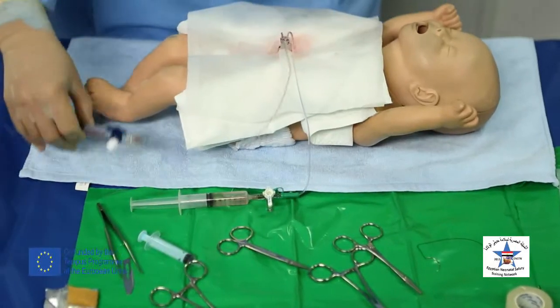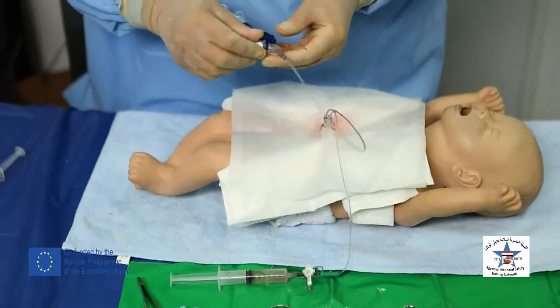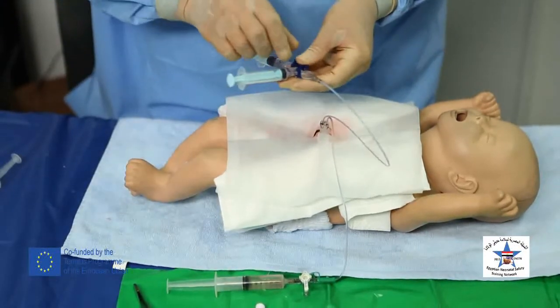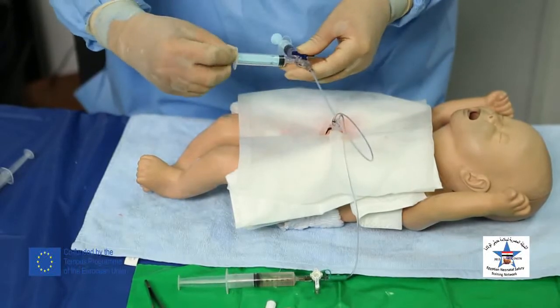For sampling of blood from the umbilical artery, we will aspirate 1 cc of blood.